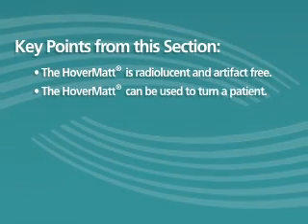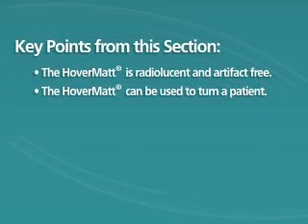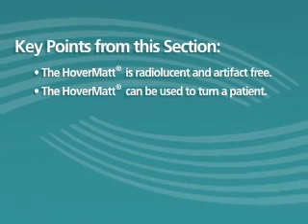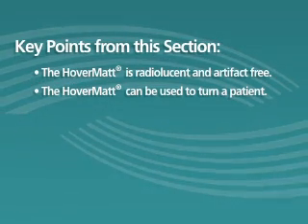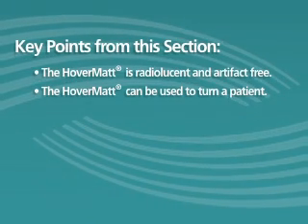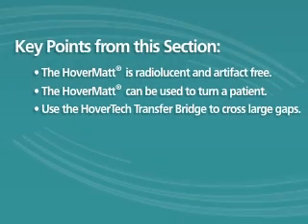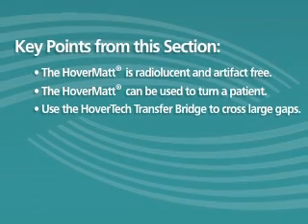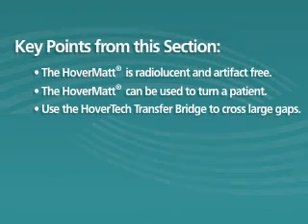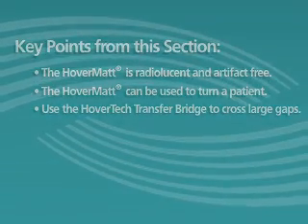The HoverMatt transfer mattress can also be used to turn a patient onto his or her side and then back to supine. For training, we use the example of a turn needed to perform a cross-lateral X-ray. You can also use this technique anytime a patient needs to be turned. If there is a gap between the imaging table and the transfer surface greater than 8 inches, use the HoverTech transfer bridge or full-length slide board to span the gap before transferring the patient onto the imaging table.